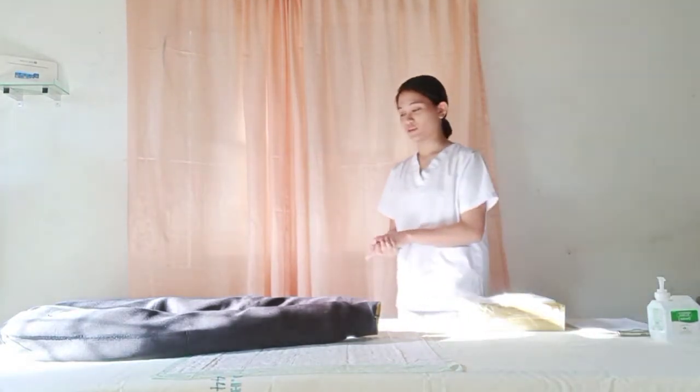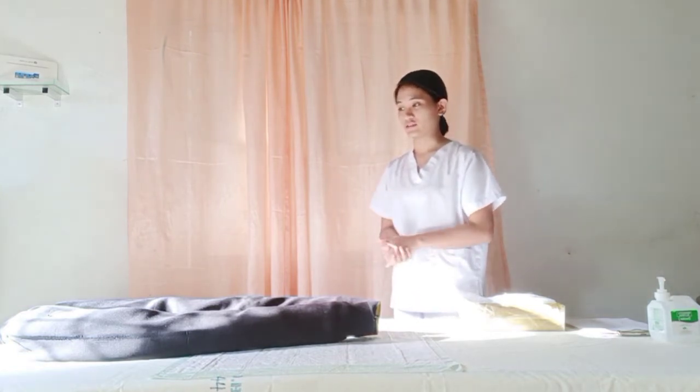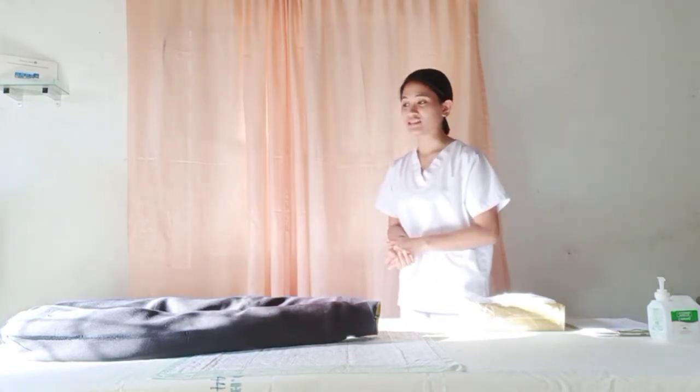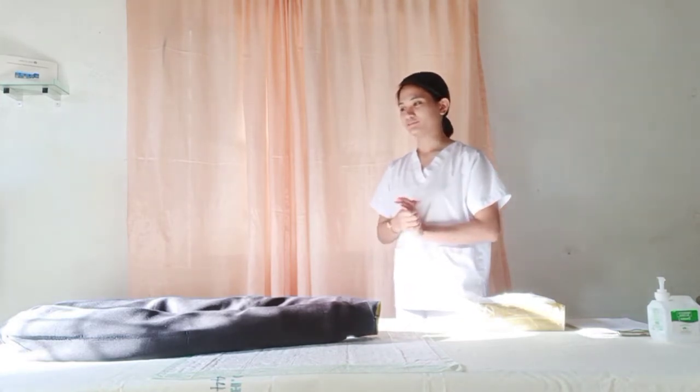Mrs. Cruz, I got an order from your physician that I need to perform a urinary catheterization on you. In that procedure, I'll be inserting a catheter inside your urethra and letting it sit inside your bladder.